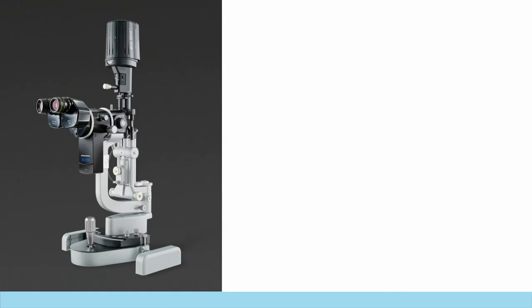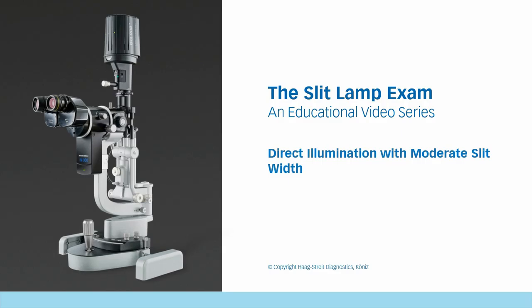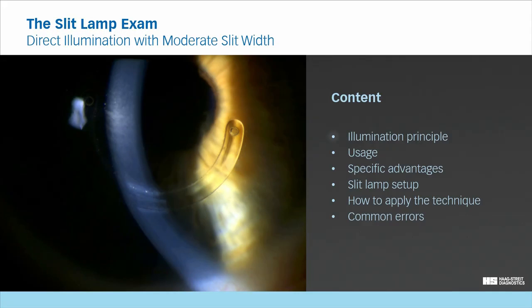Welcome to the video series, The Slit Lamp Exam. This video explains the use of direct illumination with moderate slit width in the slit lamp exam. It covers the following topics: illumination principle, usage, specific advantages, slit lamp setup, how to apply the technique, and common errors.